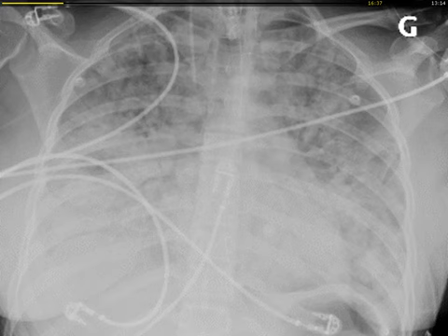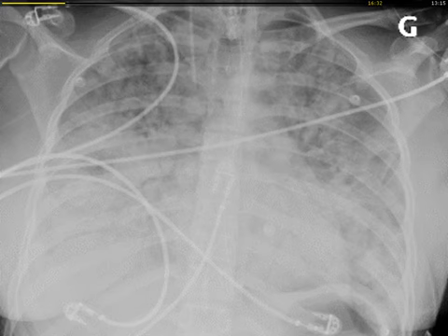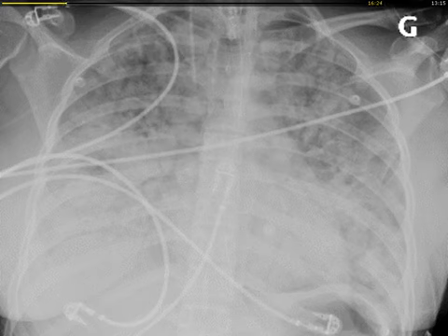Then we have automatic recruitment maneuver. At this point of time, I would be very careful to use automatic recruitment maneuver because we are not sure about the hemodynamic condition. And the limits of PEEP are between 5 and 15. Again, at this point of time, I would be very cautious and limit the maximum PEEP at 12 just because I don't know about the hemodynamic condition.